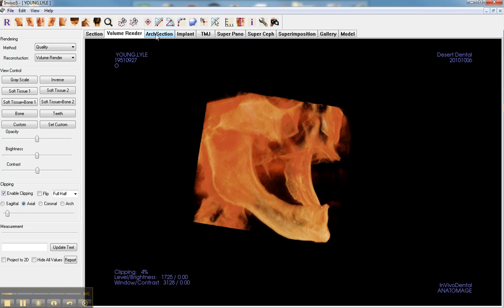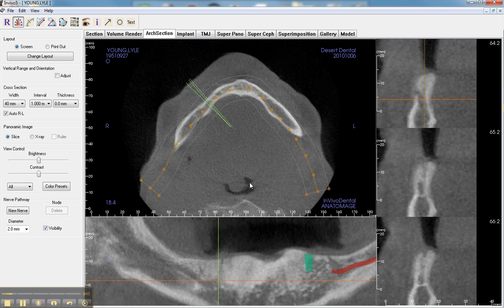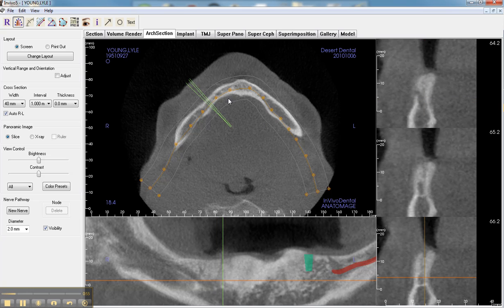There is a tab called the arch section which we utilize to trace the nerve, and as you can see there are basically three views. To read a CAT scan at first it's very difficult, but then you'll understand that it's basically not that difficult. You have the cross-sectional views.